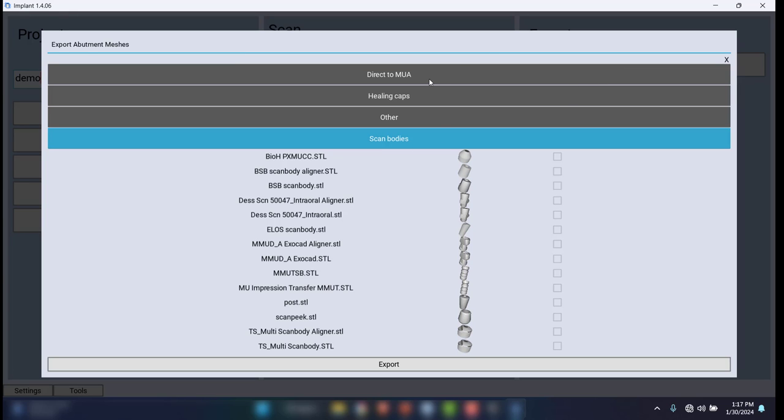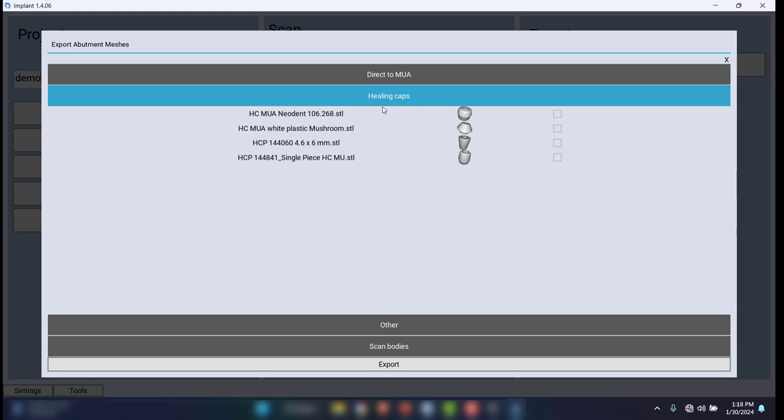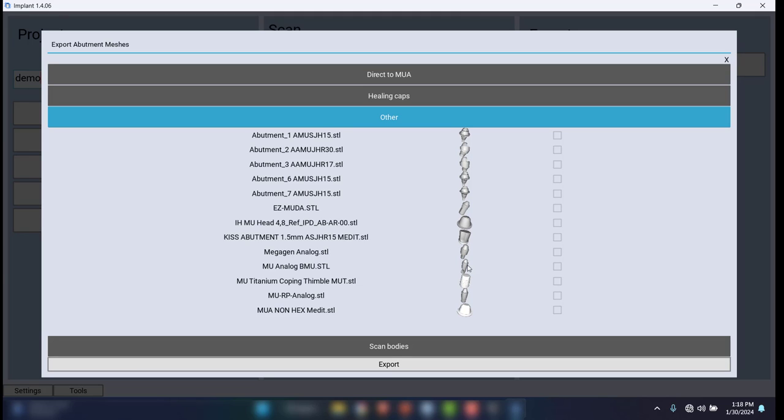You got a lot of options here of what you're going to export. Do you want to do this direct to the multi-unit with any number of the screw options that we see right here? And this is something that they'll probably continually be additional parts and pieces added to this as they're requested and as they're able to integrate those. Do you want to export this to healing abutments? Because some people will scan their intraoral scan just with healing abutments. All right, those can be used as a scan body, so you would need something you can match up. You could choose a multi itself. You could, for example, Blue Sky's multi-unit analog is the BMU analog. That would be this one right here.